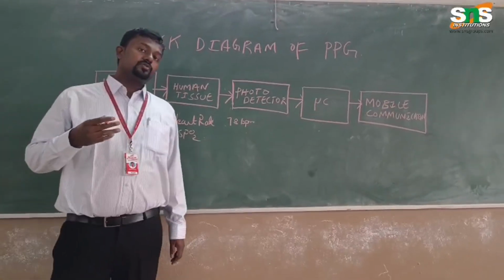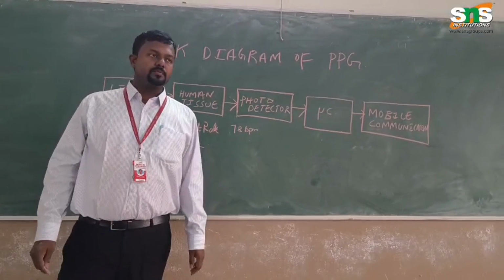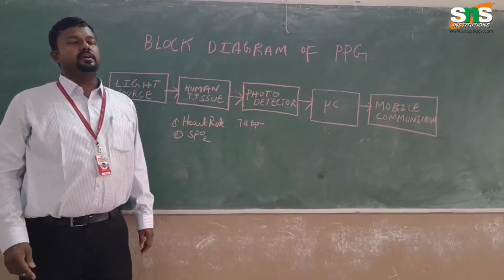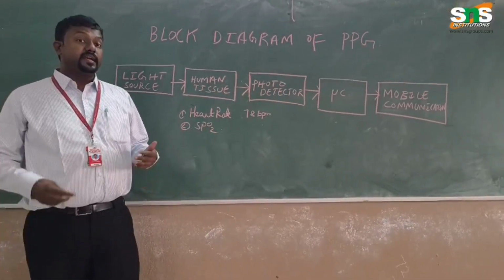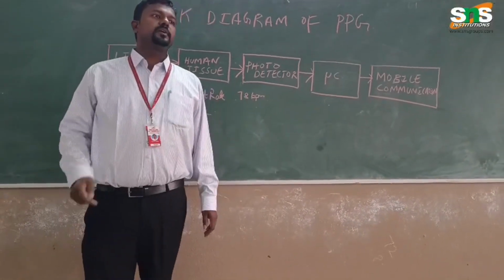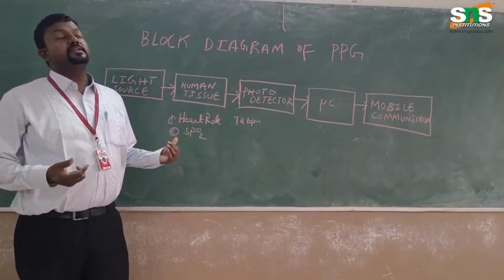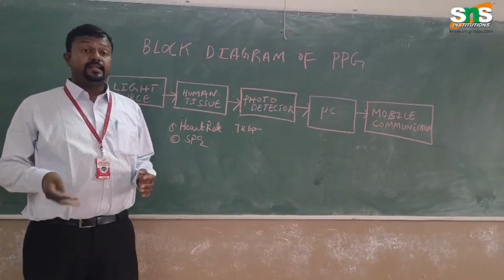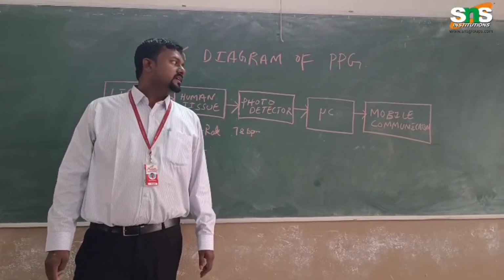If the heart rate goes to a very large extent, then we can easily say that there are some problems in the heart. Immediately the ECG signals, the echo signals, and the other treadmill tests, all the tests, BP monitoring, everything has to be done very spontaneously. Because if this basic parameter itself is a problem, then the entire system has to be checked. The entire medical monitoring is to be done very easily.